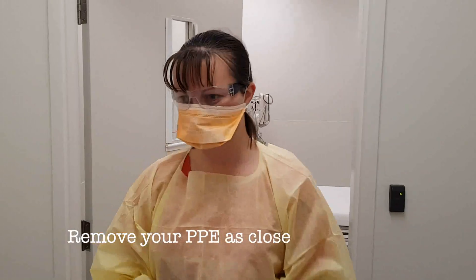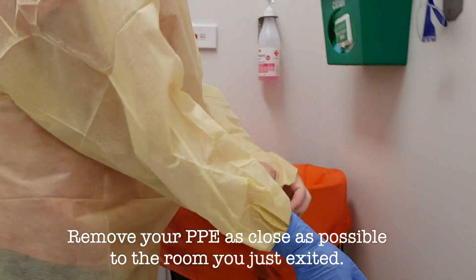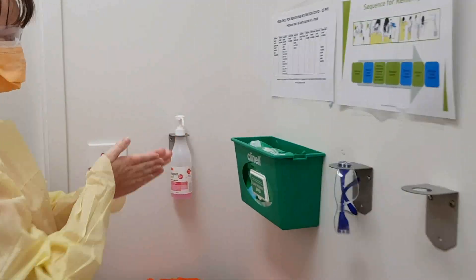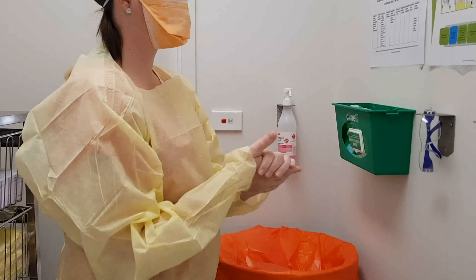As you're leaving the patient room, you need to remove all your PPE as close to the doorway as you possibly can, starting with your gloves, attending hand hygiene to decontaminate your hands before you then move to the rest of your PPE.